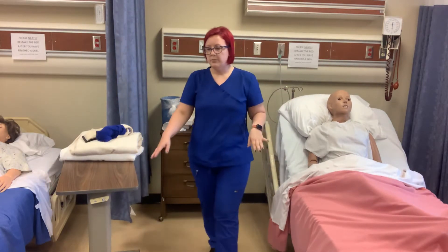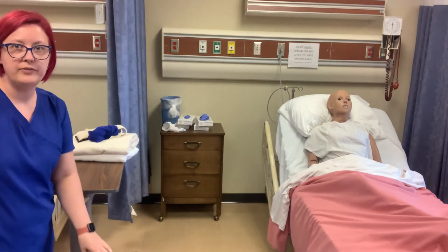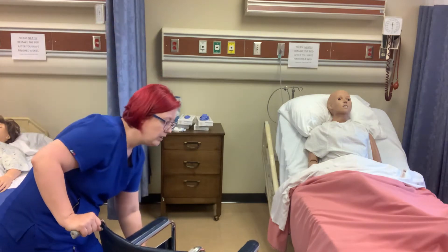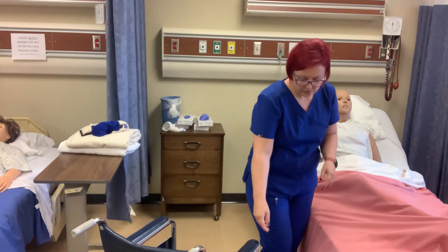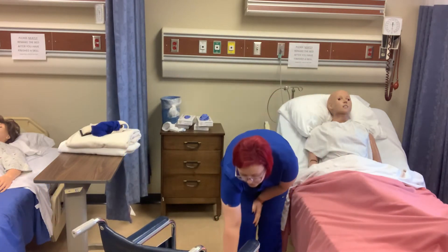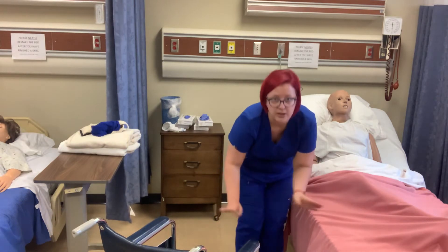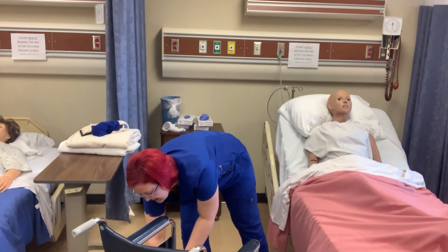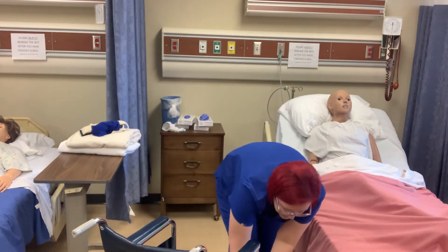So I'm going to get my wheelchair and I'm going to put it — you can either put it parallel to the bed or at a 45-degree angle. I like to put it at an angle; I just think it's a little easier. I'm going to lock my wheels, and I'm going to get the foot pedals or foot plates out of the way. I like to just swing them around to the sides.